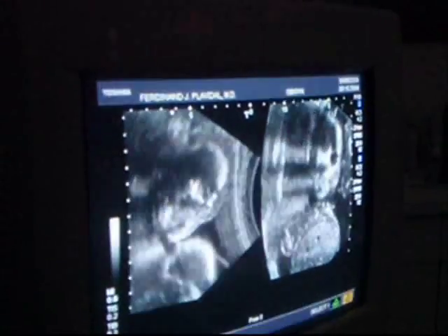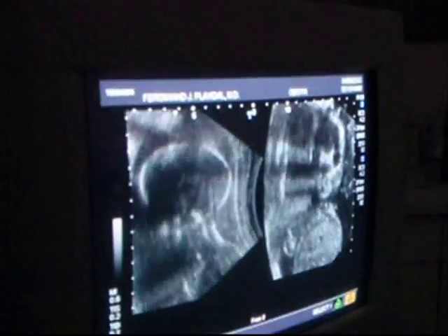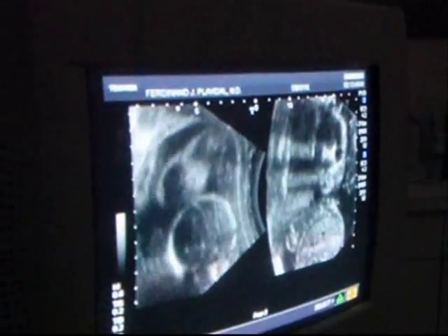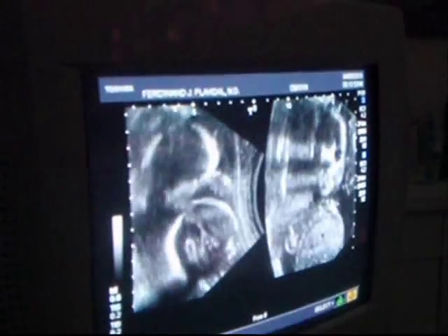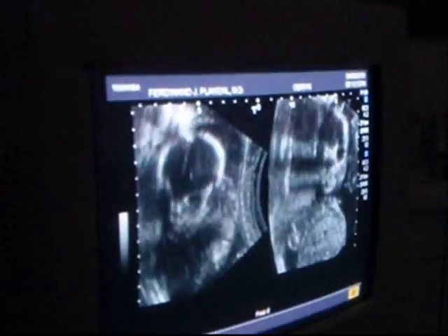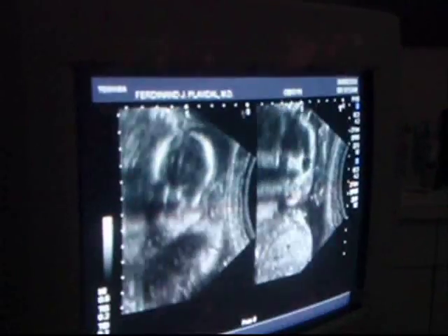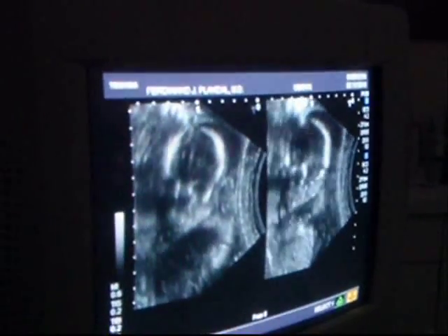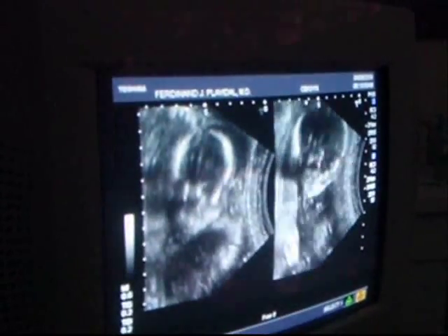this sister. And usually one of them will be terrible to photograph. One will be perfect. And one will just say, not today, I have a headache. Okay, a lot of movement. Again, you can see the hands coming up. And this is the face I'm working on right there. Come back a little bit. I'm going to hold that just in case I can't get any better. This baby is kind of looking away from us a bit.